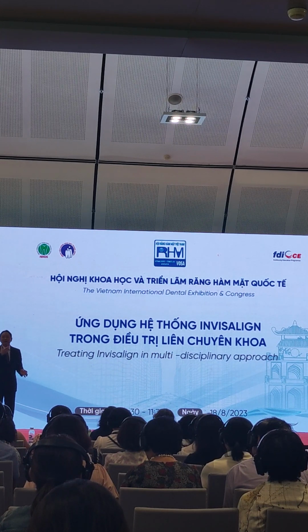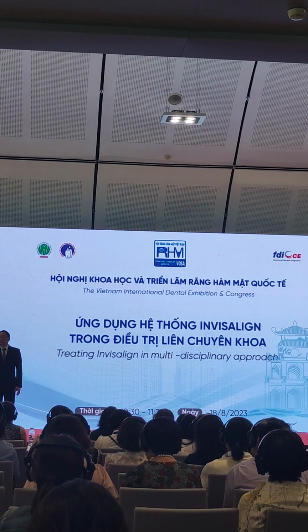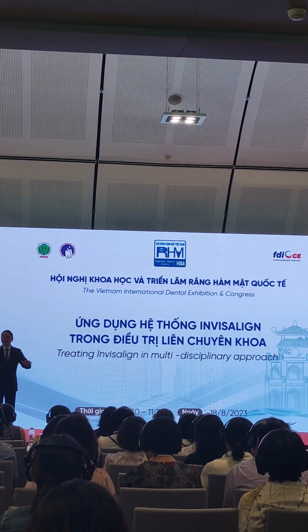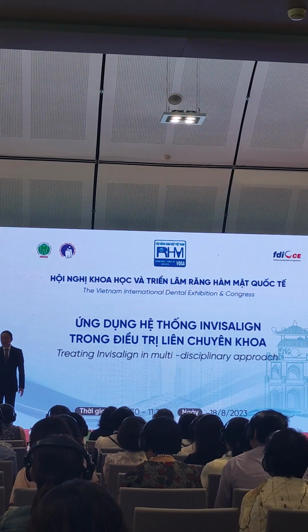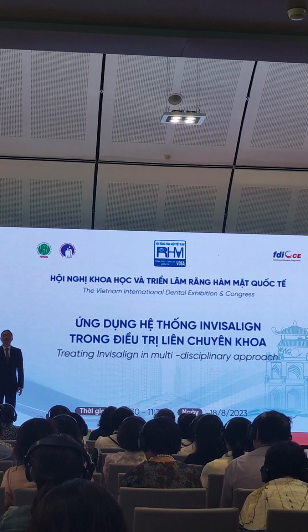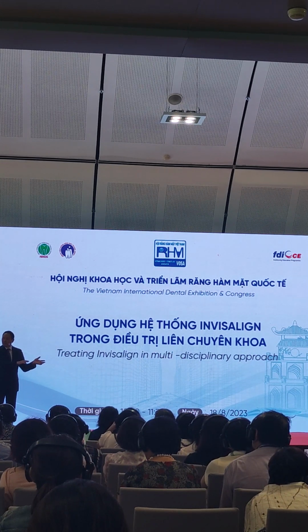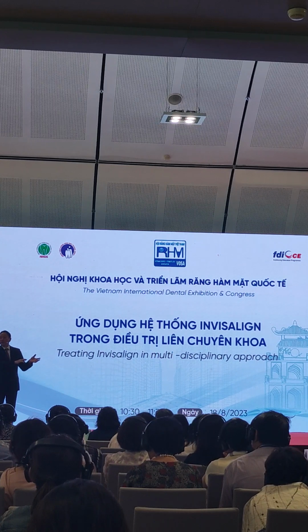Because the aligner works as a bite-raising appliance, usually it helps us. Also, when we move teeth, the aligner has the privilege that it's easy to relieve a lot of teeth from occlusion and from premature contact. But think of it from another, good side: it removes your existing poor occlusion or any interference.